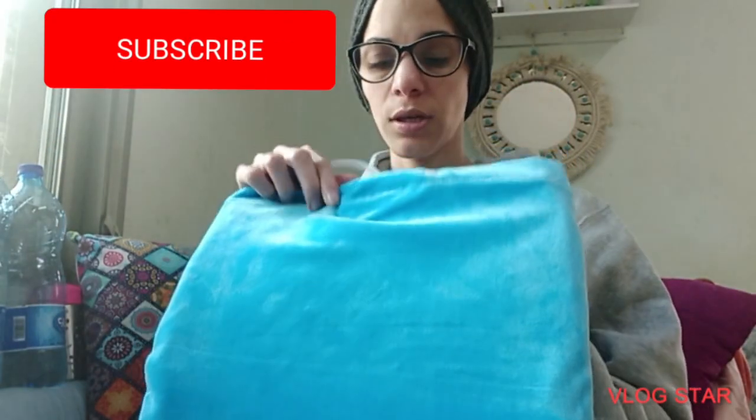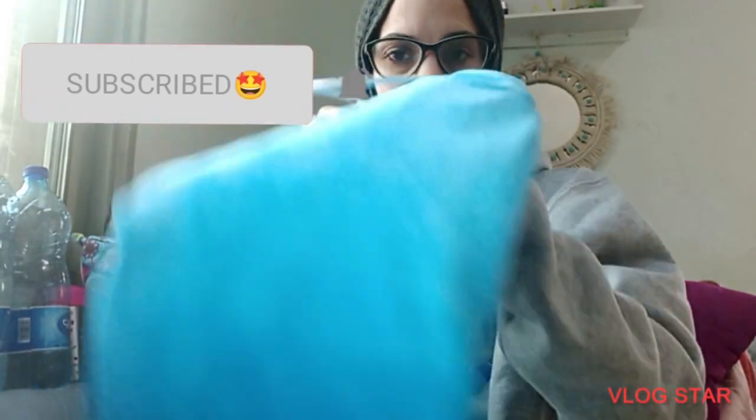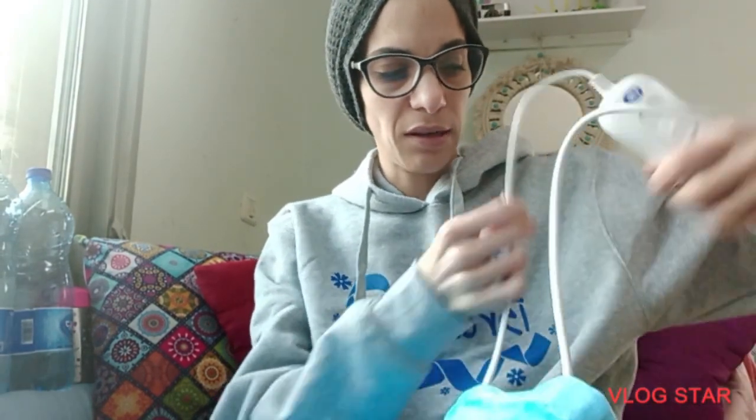First, when it's cold, and I don't know if this is the correct way to do it, but I felt that it's safer to keep these inside. The device that you click to start heating the pillow, and the wire. So when it's cold, I just put them inside because I don't want it to bend, because if it bends it will not heat the pillow.